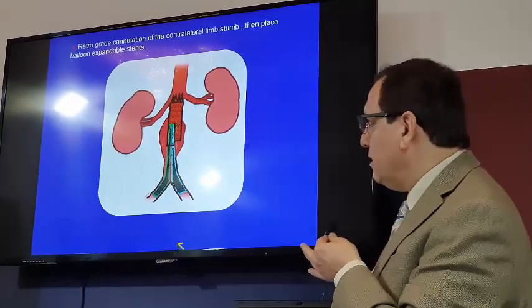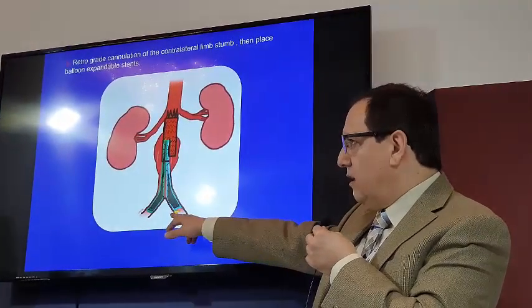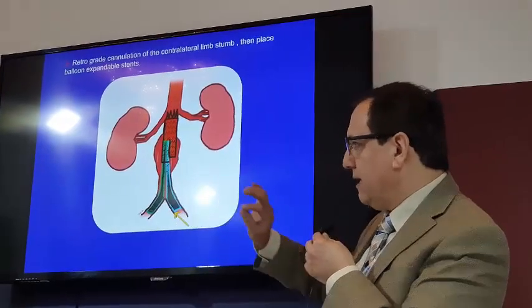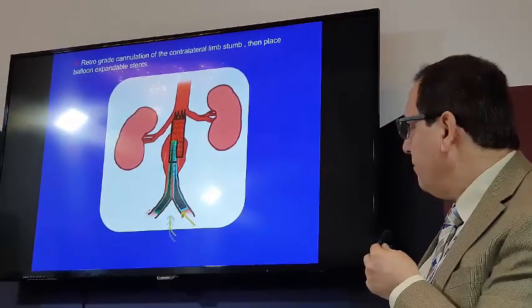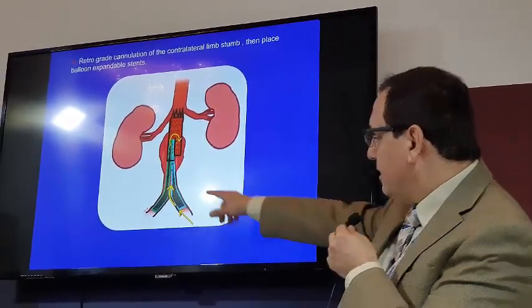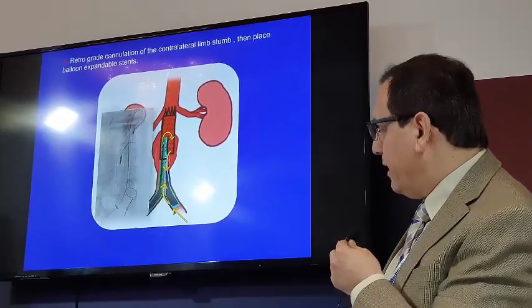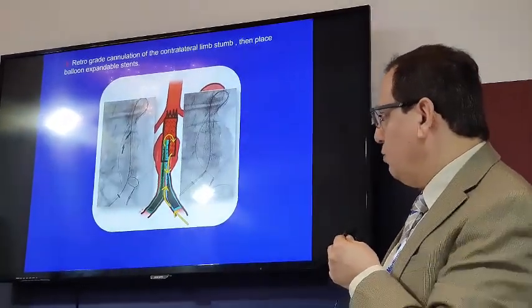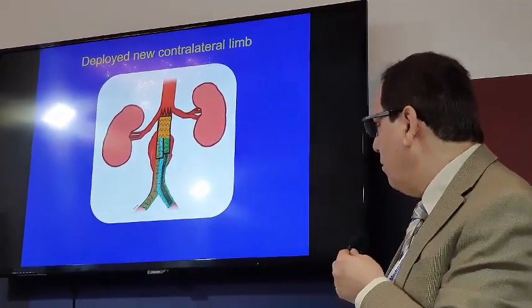That's what we did. We went from here between the graft and the iliac artery. You can always go through that by using a glide catheter, a glide wire. We get our wire inside the aneurysm. Then we went from the contralateral limb and we get our wire inside from the other side. And then we snare the wire, we flip it over, and we put a balloon expandable stent all the way inside to crush the limb between both.